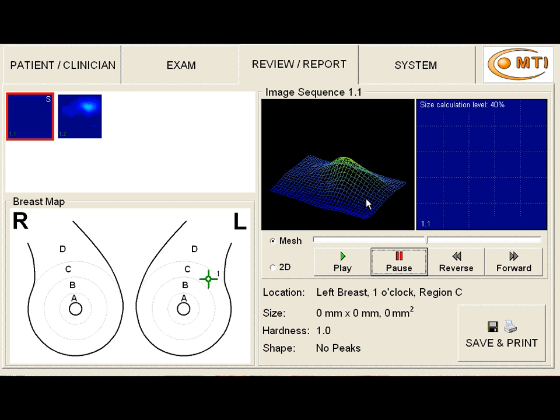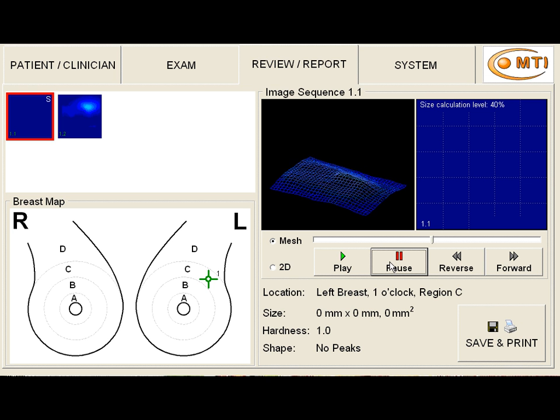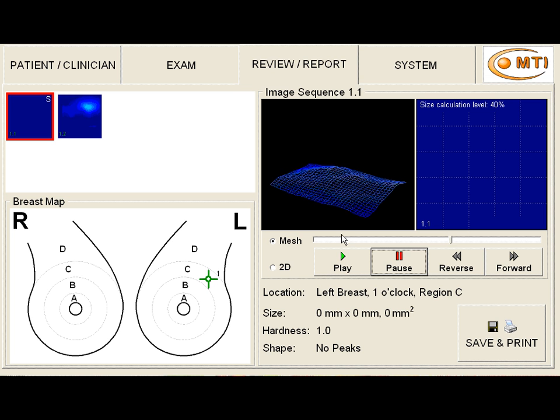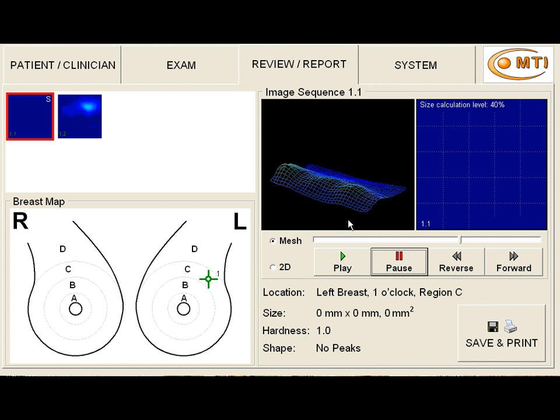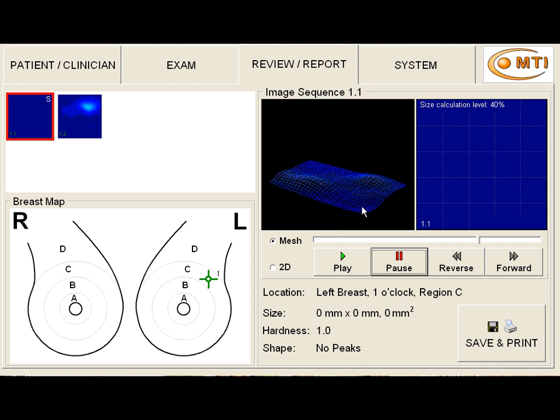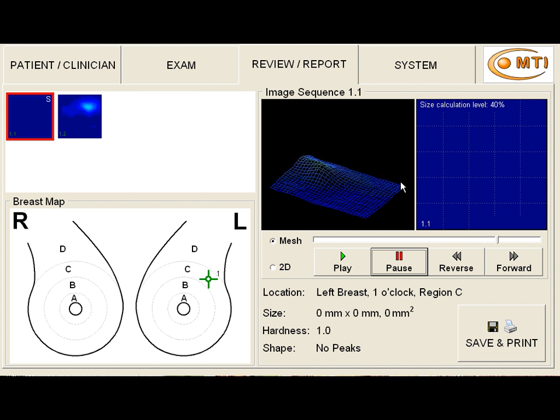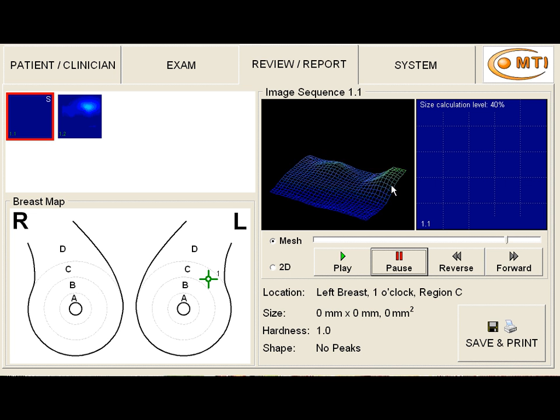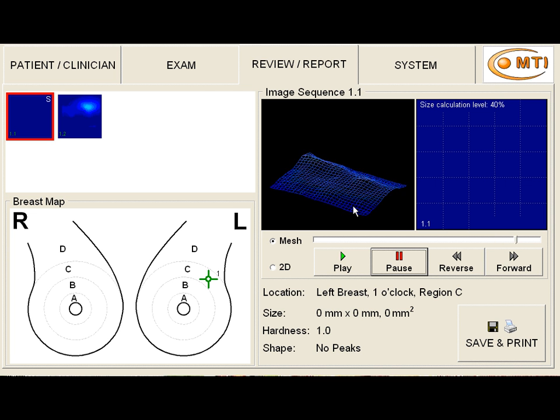But what we note is that we notice this just as we start to move in this direction. Watch again. As we move in this direction, now as we go back over the same area, we don't really see that large mass. And coming back again, we don't really see it.